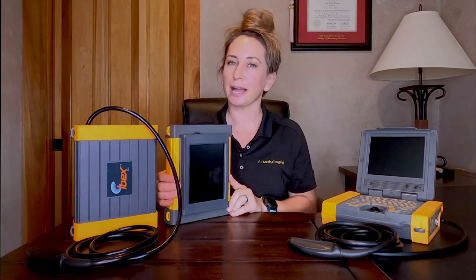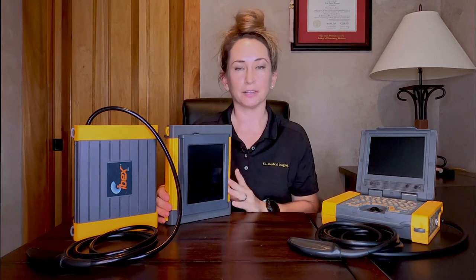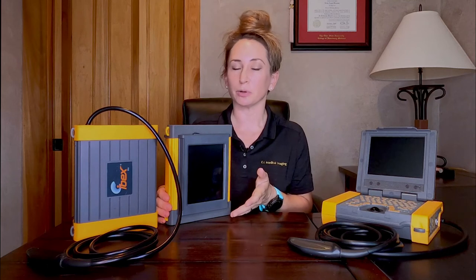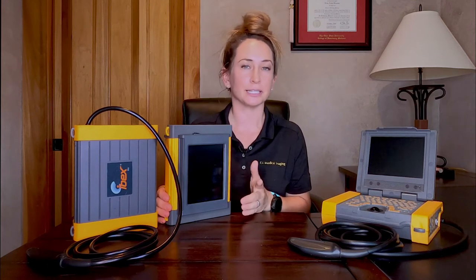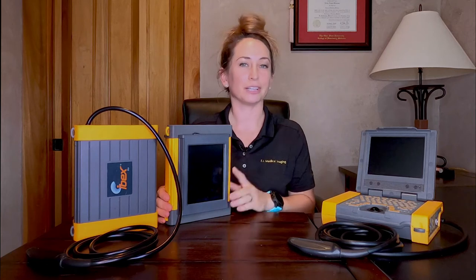The latest in the IBEX lineup is the new IBEX HR, which bridges the gap between the IBEX Lite and the IBEX Pro by having a flush-mount monitor on the side of the box. This system is a great choice for somebody who needs the self-contained mobility of the IBEX Lite but maybe doesn't prefer to use a goggle headset or needs a little more peripheral vision. It's typically worn in a hip rider harness or sling, although it could be hung from a chute, and it also accommodates the goggles.